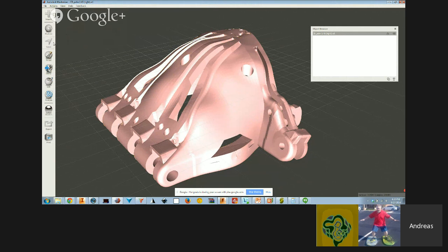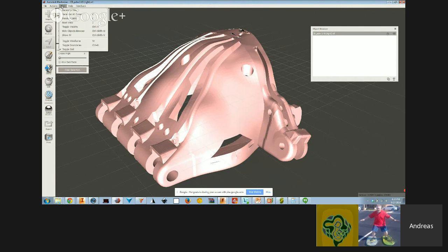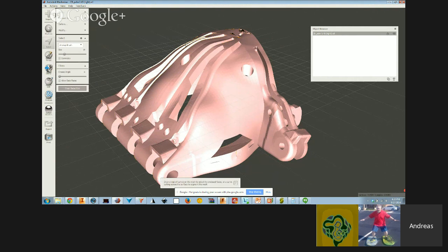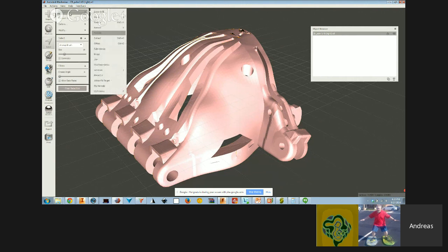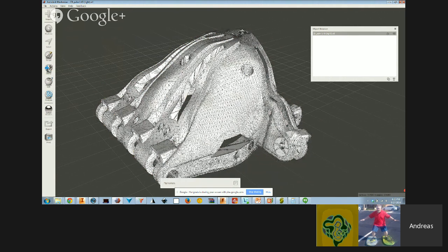If I go into my select, I guess not. I guess it's just a hotkey you need to know. Control A, select all the faces, and then I'm going to go into Edit. Again, I get certain options when my faces are selected. So right now my face selection is kind of hidden because it's reversed. So now I have faces selected, and I can go to Edit, Reverse, Flip Normals. There we go. Okay. So now it kind of looks correct to me.